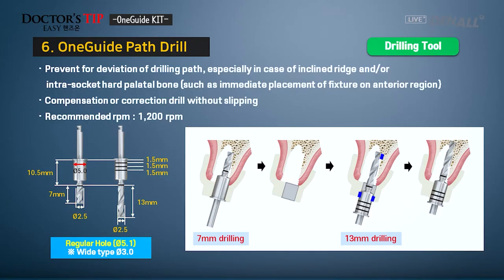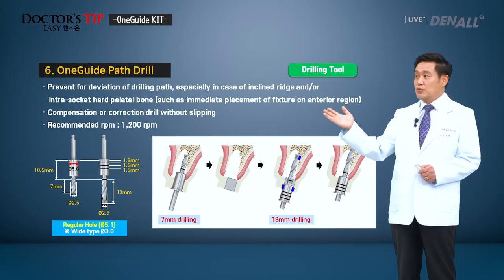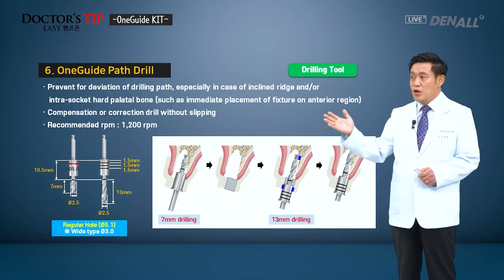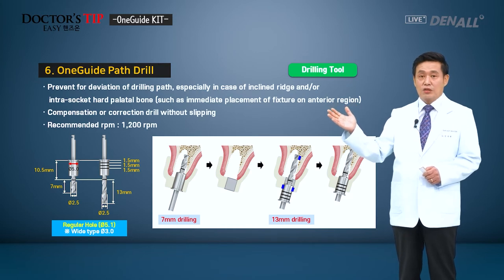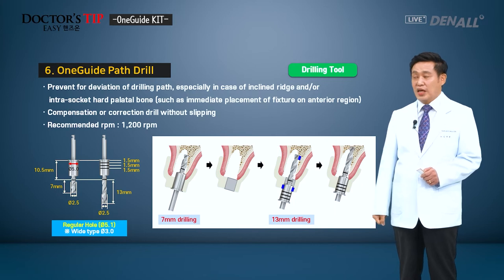This path drill is the same as the initial drill. Basically, you do 7 mm drilling first and then, using a longer drill, drilling is done using the double contact concept. When placing in the upper anterior socket, no additional work is needed for you to drill stably when you use this OneGuide path drill.